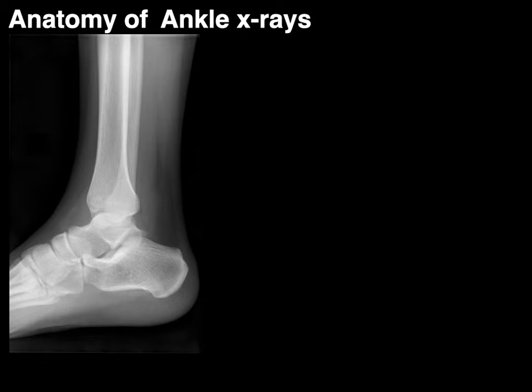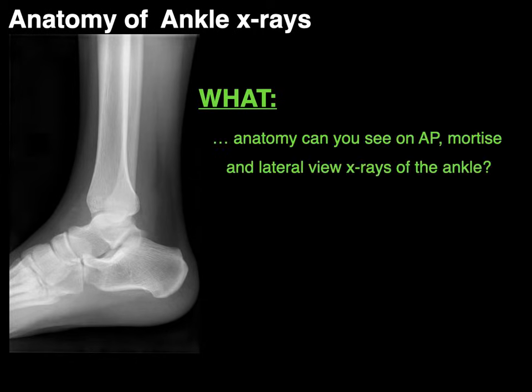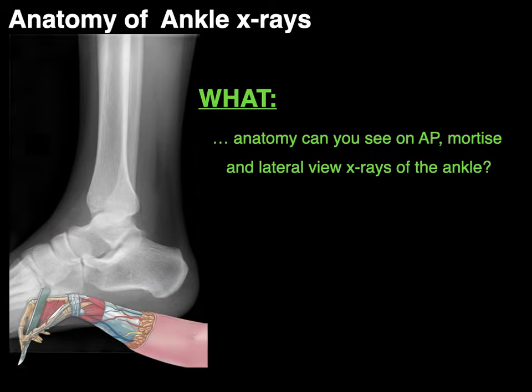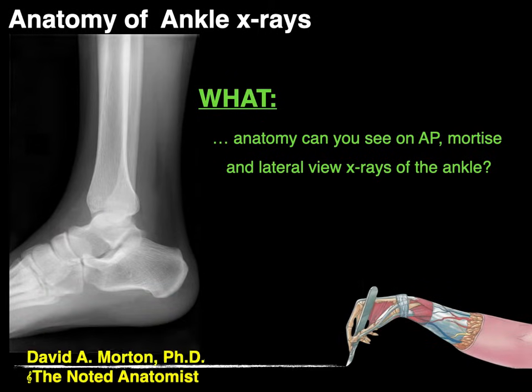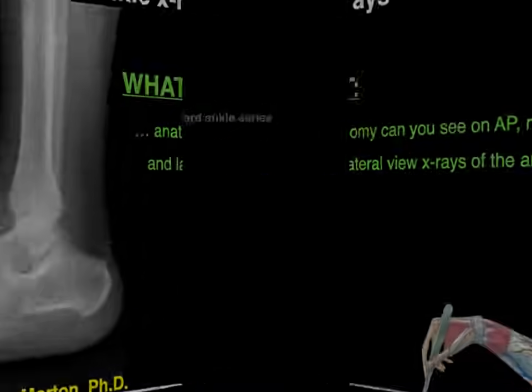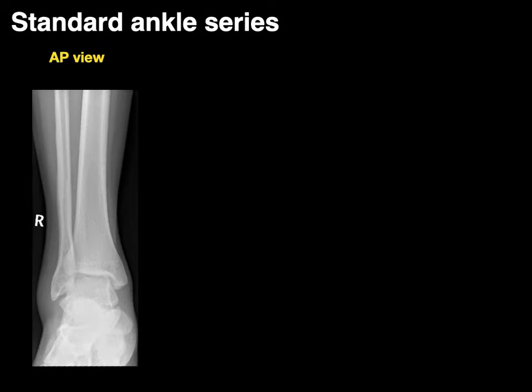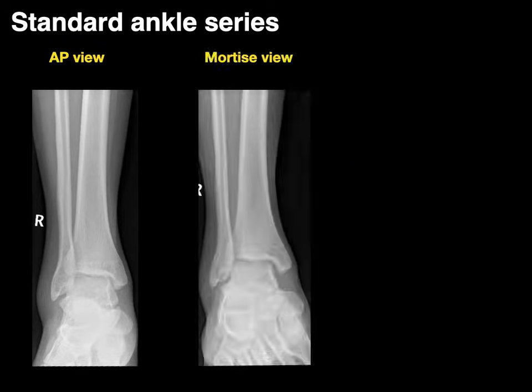We're going to talk about the anatomy of ankle x-rays and answer the question: what anatomy can you see on AP, mortise, and lateral view x-rays of the ankle? My name is Dr. Morton and I'm the noted anatomist. The standard ankle series we're going to go through are an AP view, a mortise view, which I'll explain about more later, and a lateral view.